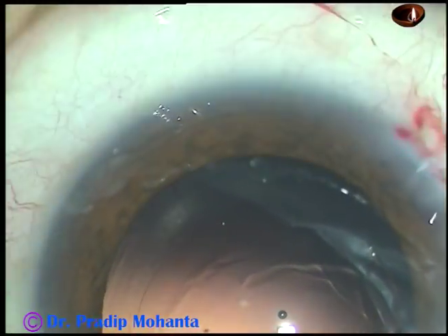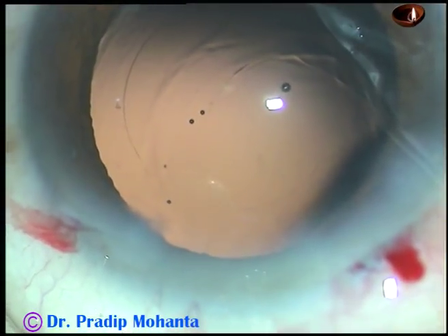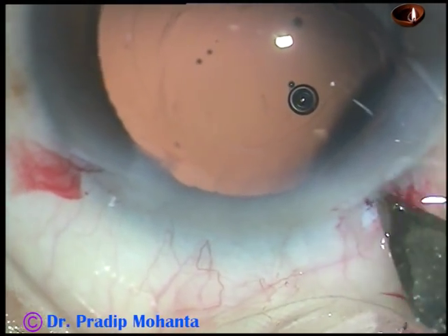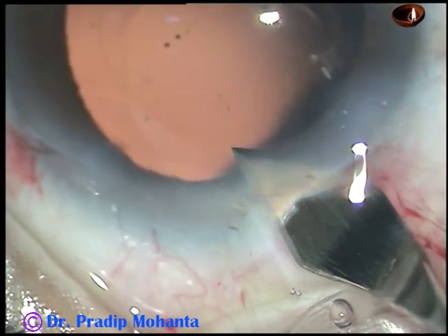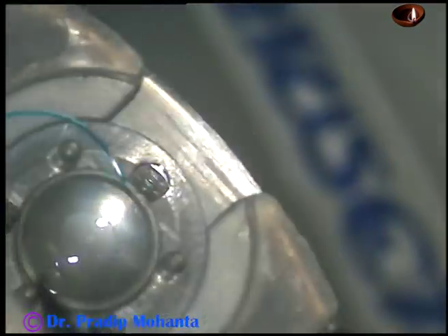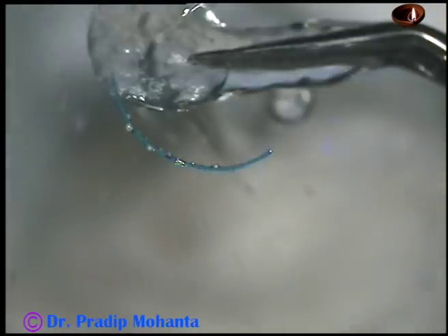Visco has been injected to fill up the anterior chamber and the capsular bag. In this case, a multipiece intraocular lens was selected because there could have been a posterior capsular rent. The main incision is enlarged a bit — enlarged to about 3 mm; it was 2.8 mm, enlarged by 0.2 mm. This is the Sensar multipiece intraocular lens from Abbott Medical Optics. No financial interest. Let us see how to load this lens.